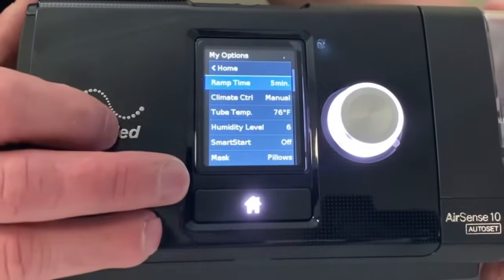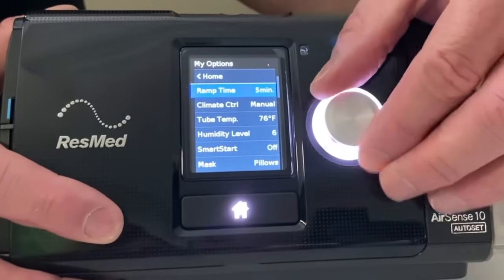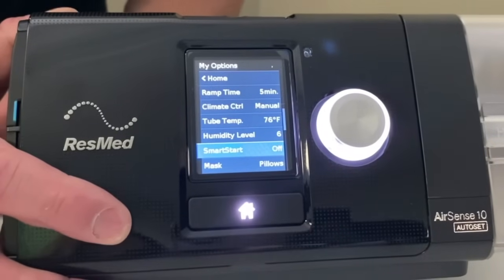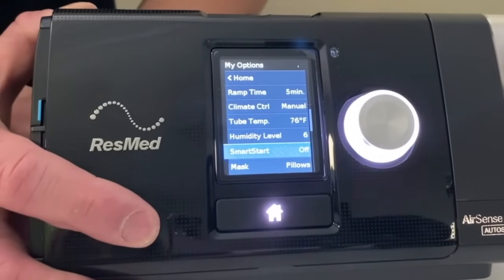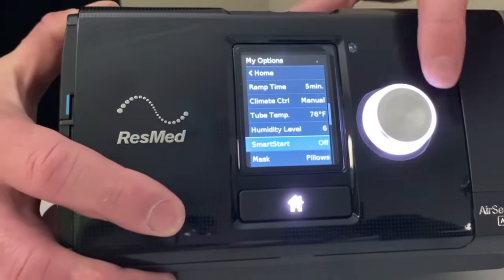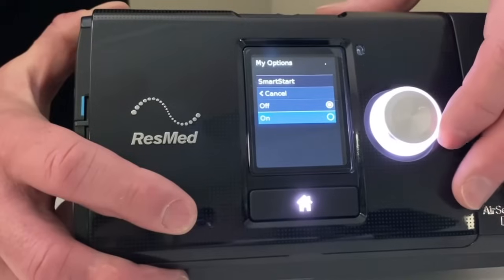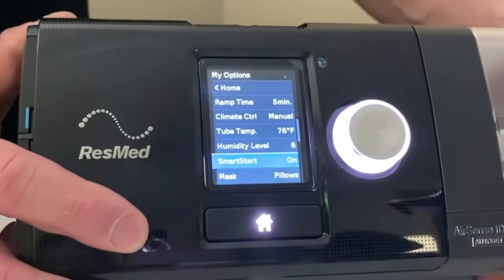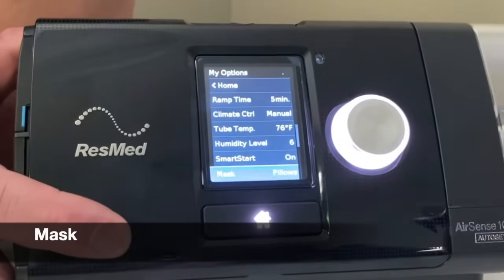Humidity settings we'll go over in just a little bit, as finding the right settings can be tricky. Scrolling down, smart start — I usually leave that off. The theory behind smart start is that when you breathe into the machine, it should start up by itself. Sometimes it works really well, sometimes it can be quirky. You can highlight anything here, click on it, and go wherever you want. I'll turn it on just for demonstration purposes.